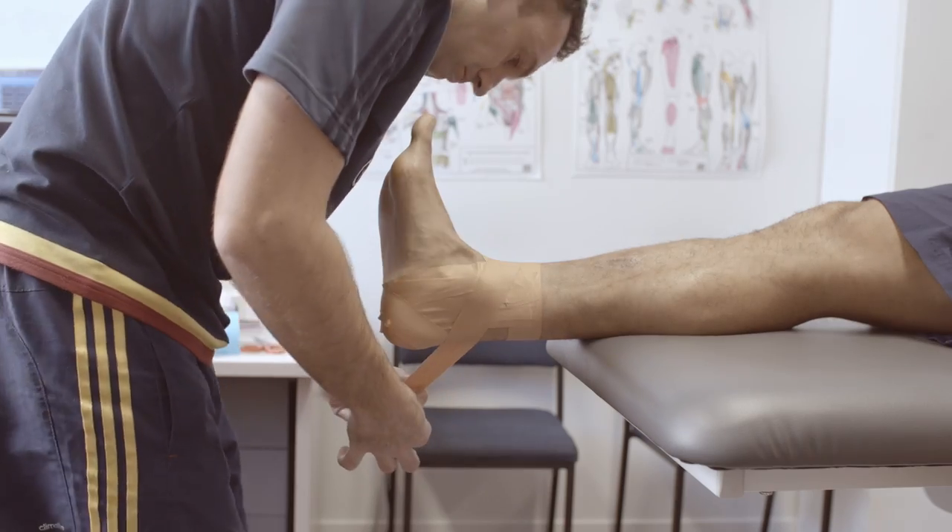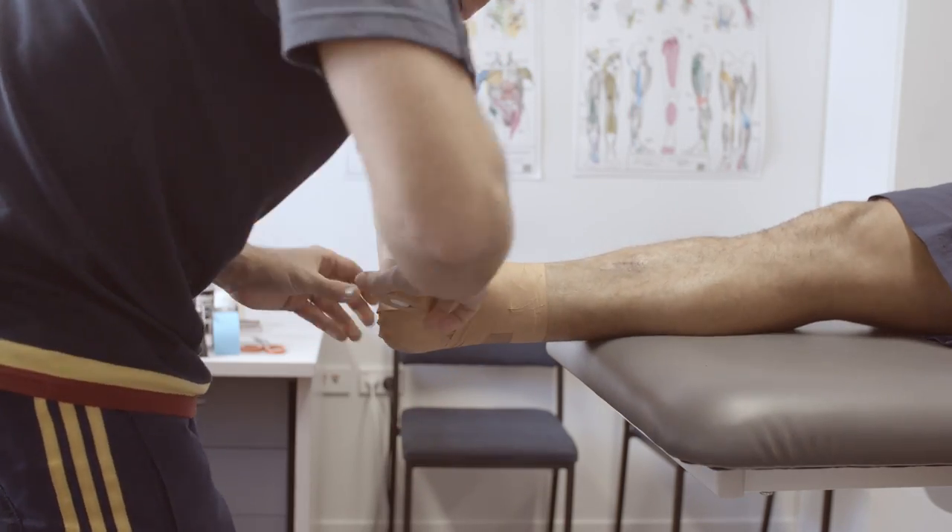The main thing we use this for is to support a joint — so for rolled ankles and knees, that sort of thing, to hold them straight. So to stop a knee falling inwards, to stop an ankle rolling. Certainly for players returning from injury, this is a really useful product. Thank you.